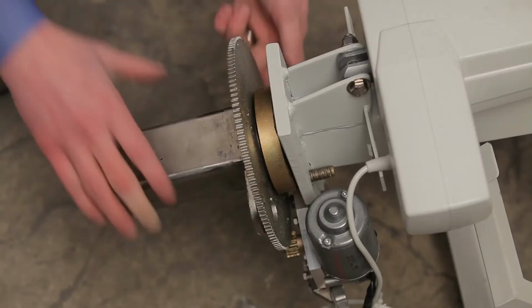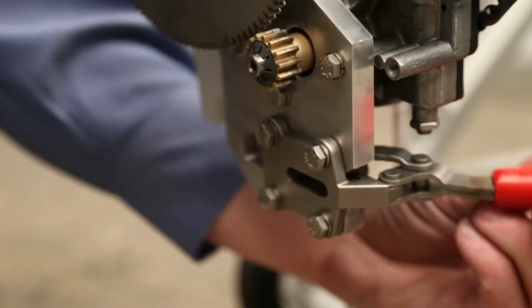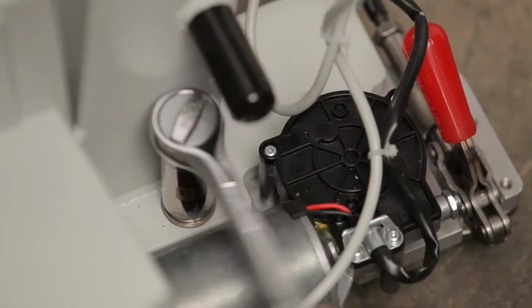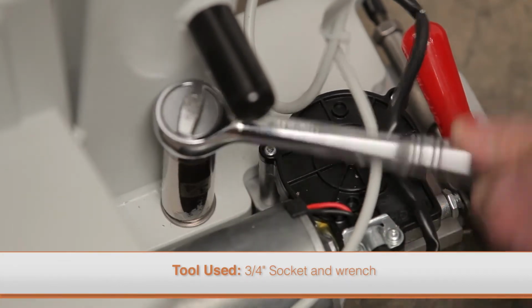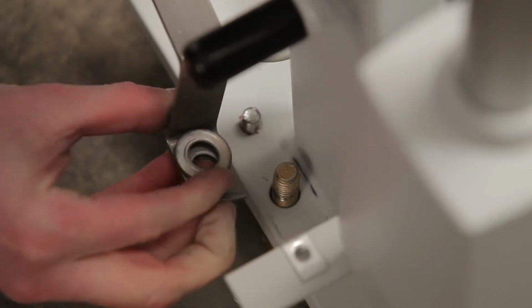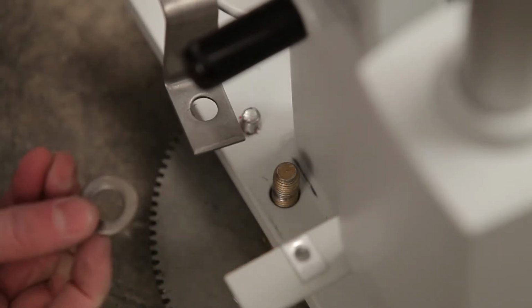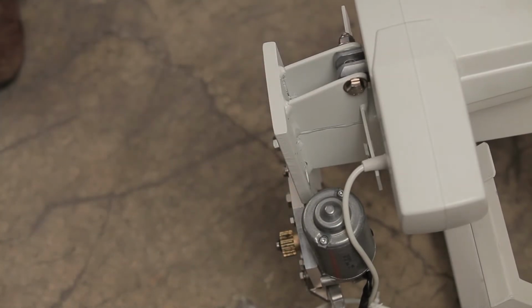If the large gear is damaged, then the hub assembly needs to be replaced. First, disengage the toggle clamp. Remove the two nuts from the mast base using a deep well socket. Remove the support bracket that holds the terminal block, making sure the motor cable and cord are not damaged. Grip the hub assembly by the base and gently pull it from the mast.